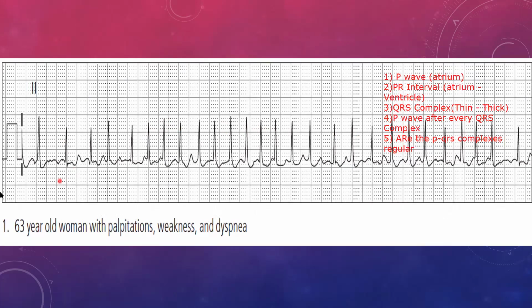It just keeps on moving in its own pattern. So there's a few things that it could be. There's a few things that cause the atrium to give us a very odd look here, and to also give us a signal that is passed on to the ventricle.